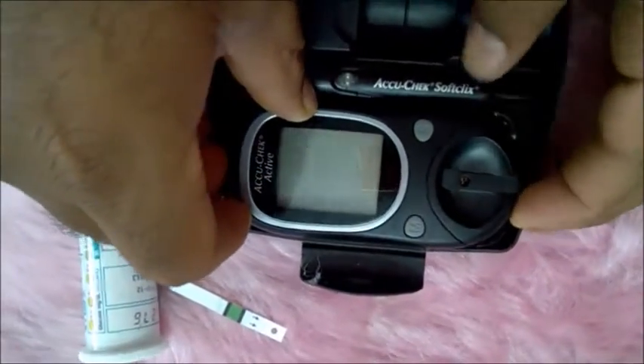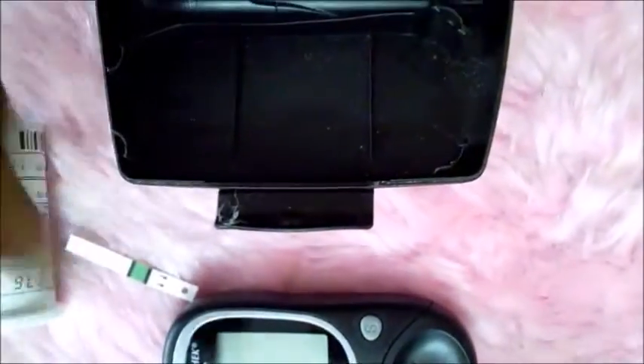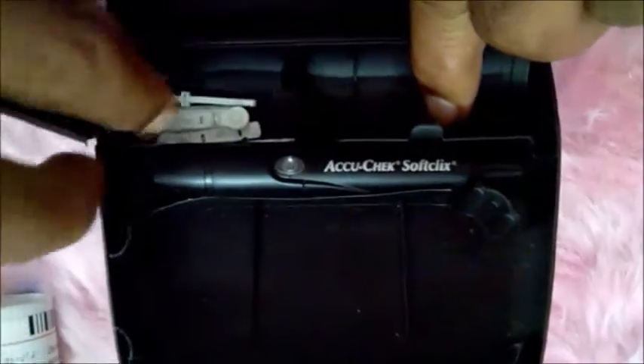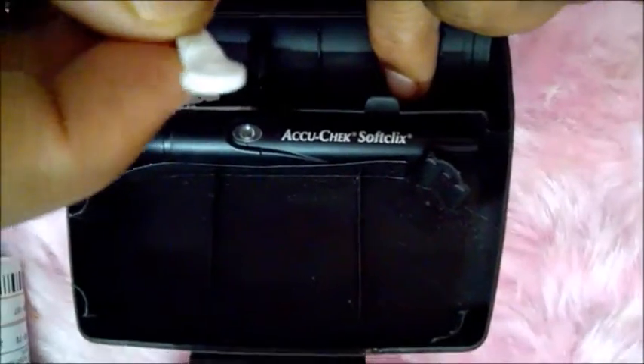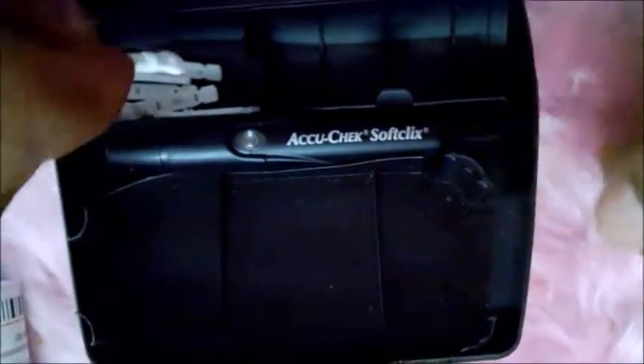This is the actual machine which will give you a digital reading. M stands for memory, where you can see your past readings. This is the small compartment for keeping needles. A new needle can be twisted, opened, and put in. This is just like a ball pen — it can be opened from the front side by pulling out.